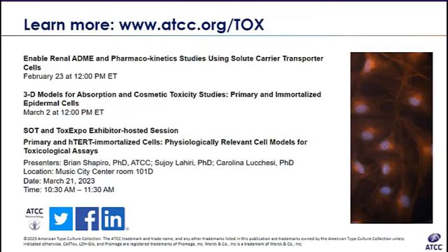Well, I'm not an expert at this particular thing, but I do know that we prefer to use hTERT alone to immortalize cells. But I do know that there are some cases where it's not enough. So for example, certain cell types do require additional modification. I think keratinocytes require expression of a modified hTERT as well as CDK4. So it's not a universal thing, but we do prefer that.